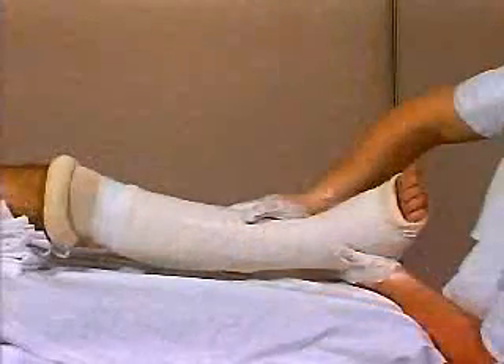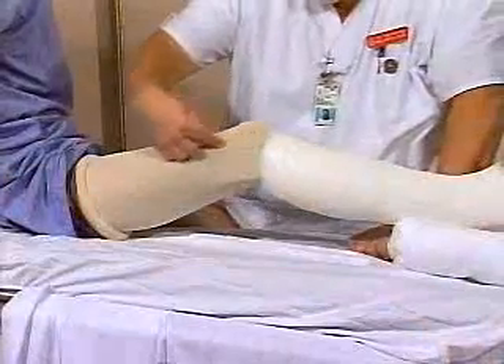For some ankle fractures, mold in inversion. Place the knee at 20 degrees.